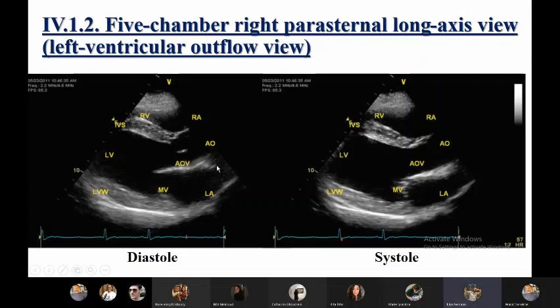During diastole, the mitral valve, chamber size, wall thickness, and left atrial size are assessed. During systole, the mitral valve should not prolapse back into the left atrium and is thin with uniform thickness as before. The left ventricular wall and interventricular septum should be parallel and similar in thickness as before as well. The aorta and left atrium are similar in size. The right ventricle should be 1/3 to 1/2 the size of the left ventricle.